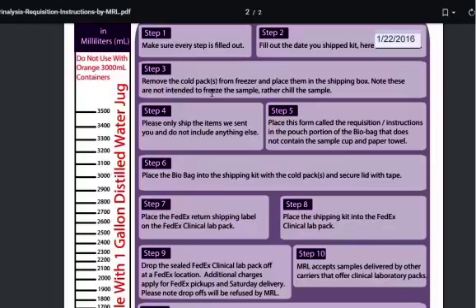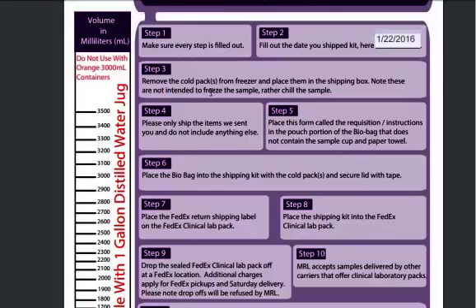We've done this for so long, so don't add your own freezer cubes. We get all kinds of crazy things in these kits. We have people that put ice in a Ziploc baggie. Well, on the tarmac when it's 120 out there, that ice doesn't last long, and neither does this freezer pack. But the freezer pack keeps it cool a couple more hours, which helps.